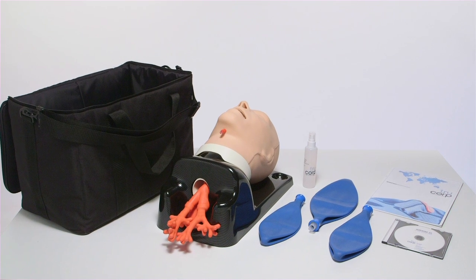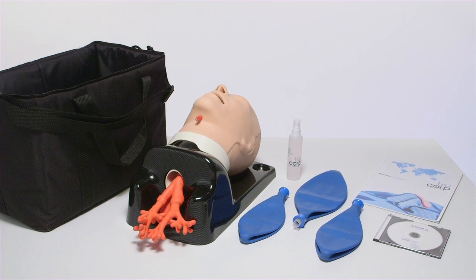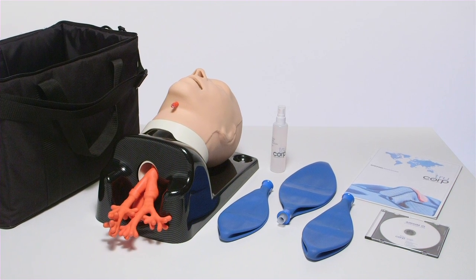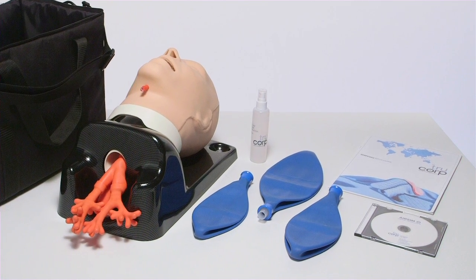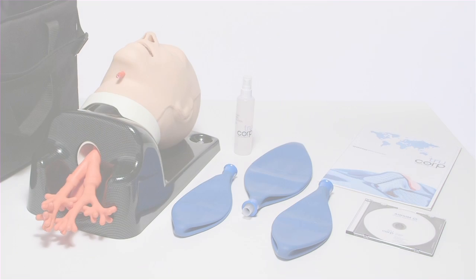The AirSim Advanced Bronchi comes with a bottle of lubrication, a shipping brochure, a CD user manual and three blue bags to illustrate both stomach and lung inflation. The lightweight mannequin is delivered ready to use in a black carrier case, ideal for course providers and medical device sales professionals on the move.